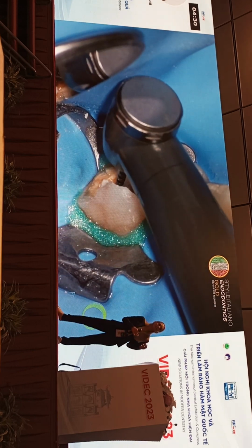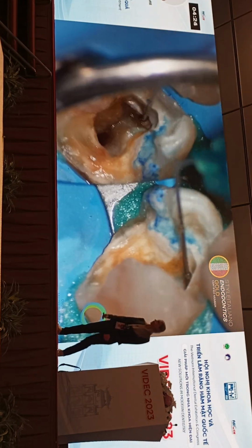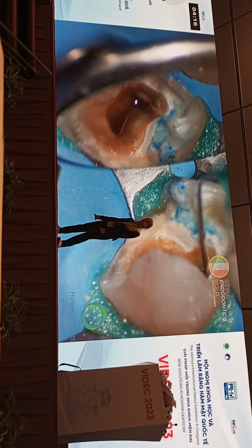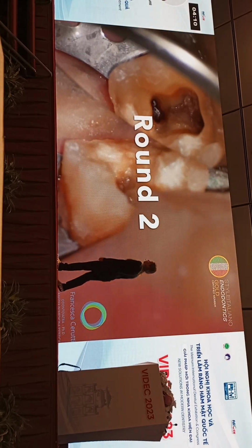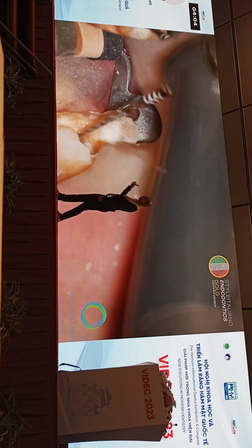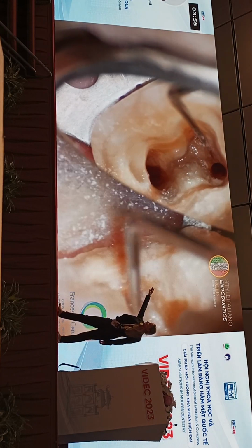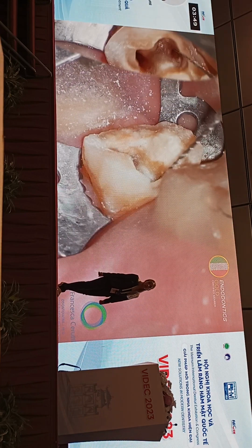And then I start from the easiest canal. In lower molars, the distal, because it's large, and go shaping it. And then, which is the second easiest canal in lower molars? The mesiolingual, because it's bigger and straighter than the mesiobuccal. So I start with that. Also because many times in lower molars, the two mesial canals have a confluence. So I want to shape to the apex only one canal and shape the other canal just up to the confluence. And the map on the pulpal chamber floor is guiding me to find where the root canal opening is.